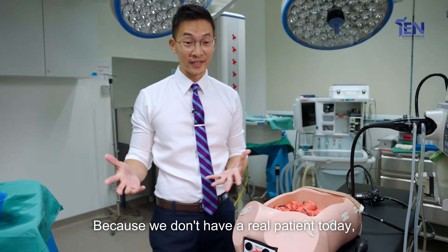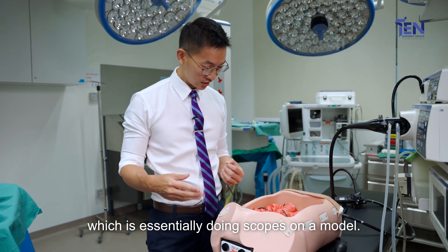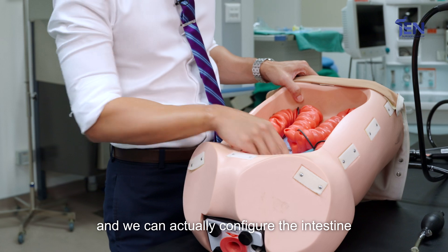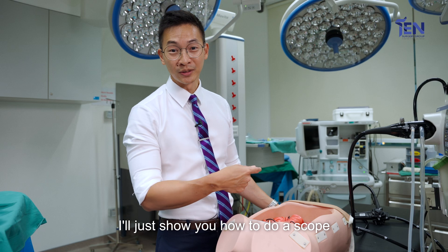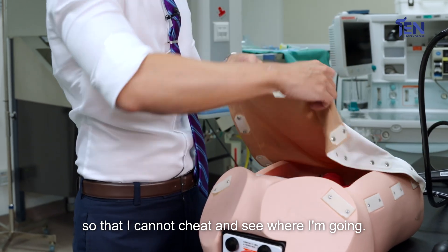Because we don't have a real patient today, we're going to show you what we do in training, which is essentially doing scopes on a model. You can see the model here — it's like a real colon with an abdomen. We can actually configure the intestine to a way that matches the difficulty of the learner. I'll show you how to do a scope through this model and we'll cover it up so that I cannot cheat and see where I'm going.